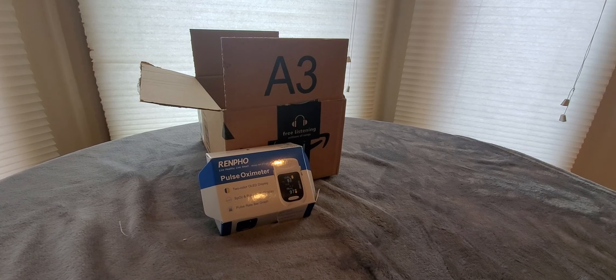Especially during Christmas, so this would be a nice little stocking stuffer to give somebody. They've got these batteries sealed really good. Amazon brand batteries are really good also. It's gonna take me like six minutes just to get these batteries out. Alright, we got them!